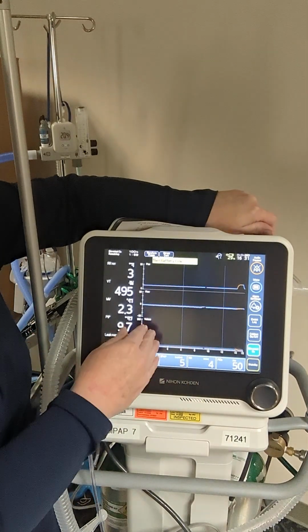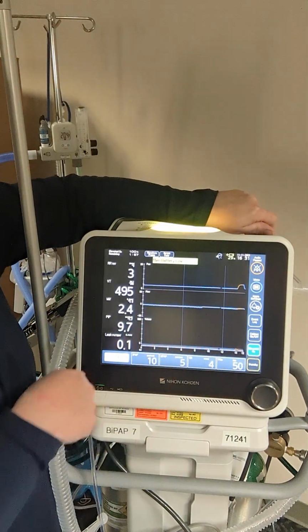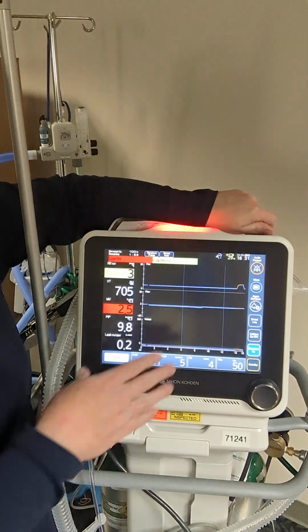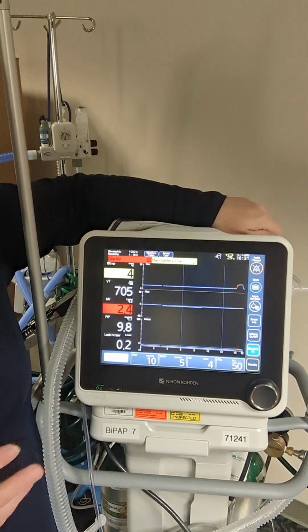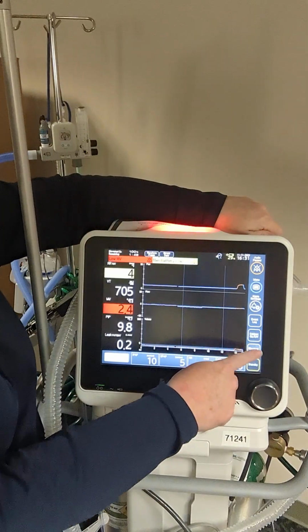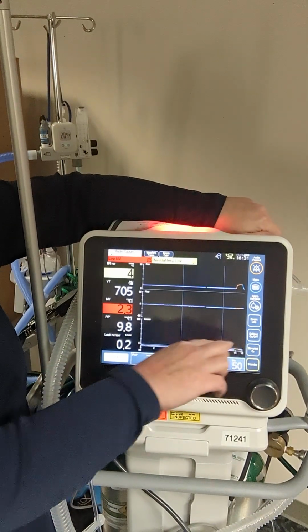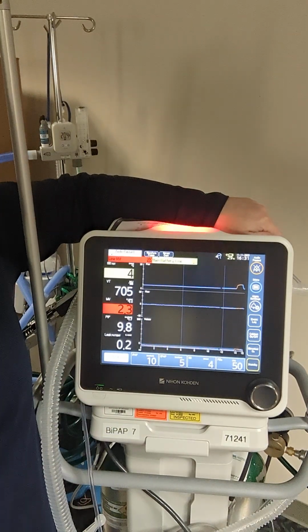Now, we press start and this button has turned blue, so that's letting you know, oh hey, you're giving 100% oxygen and this is going to last for 2 minutes. Then the blue light is going to turn back to the way it is without, and so you know that 2 minutes is up.